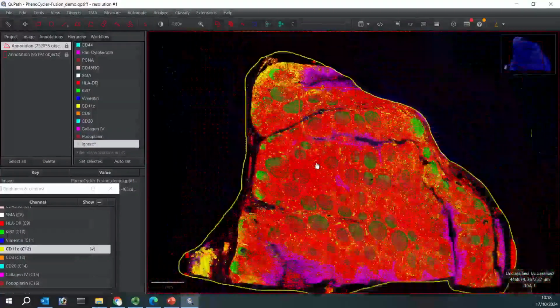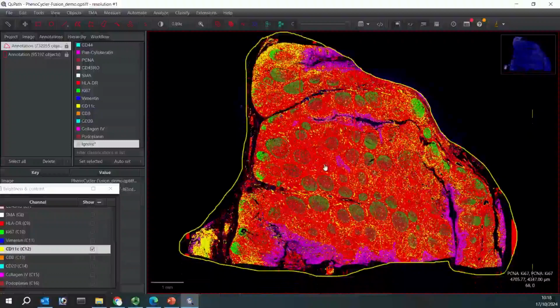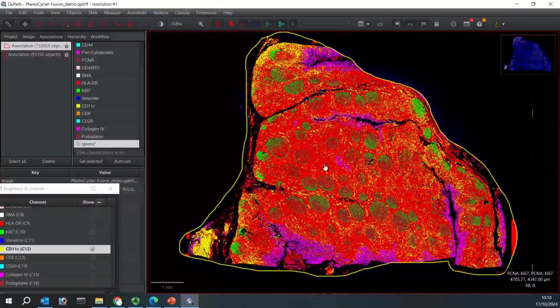So for the demonstration today, I only did 5 channels. When you actually analyze your own image, you need to go through all the channels, but the process will be the same. Okay, that's today's demonstration. I showed you how to use machine learning methods to perform multiplexed analysis.